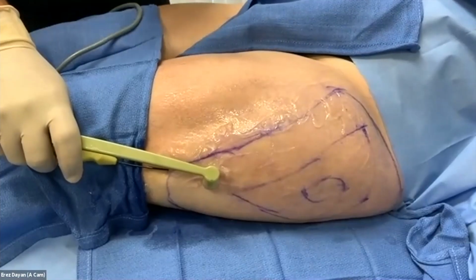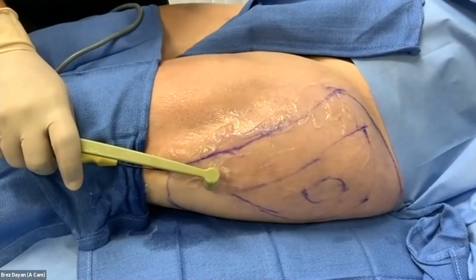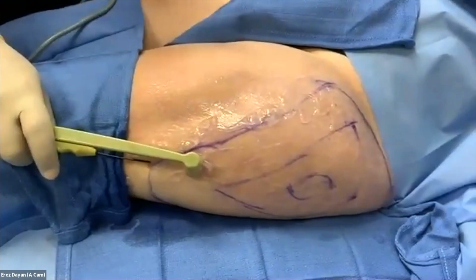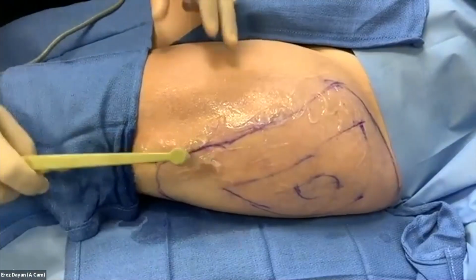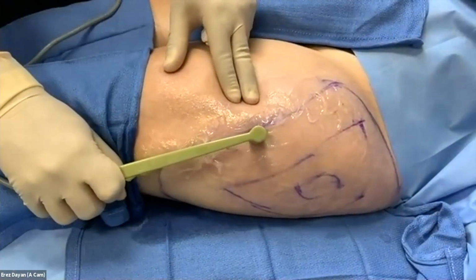And I like that. It sounds a little bit like a slot machine, which is ironic because we're in a gambling kind of area. But I guess patients are used to it here. But we're just going to go slowly. So when I hear a slow beep, that means I'm farther away from target temperature. And then as I hear a faster beep, that means I'm approaching target temperature. So when I hear a slow beep, I move slow. When I hear a fast beep, I move a little faster, and that's kind of it.